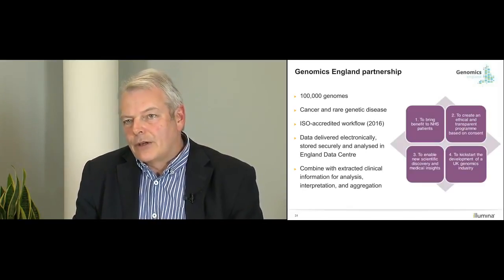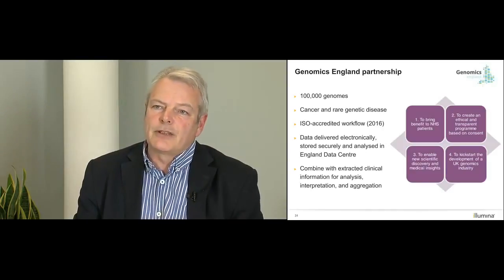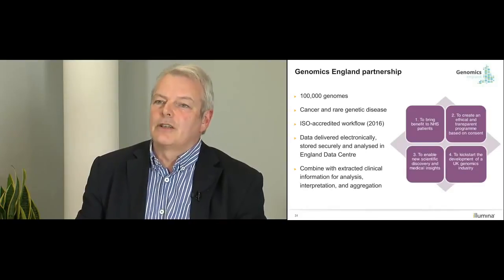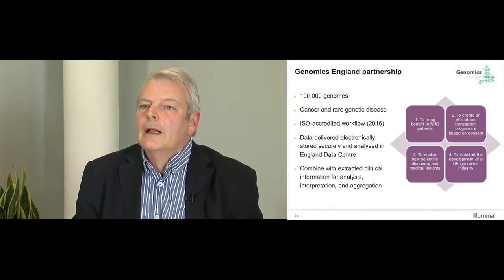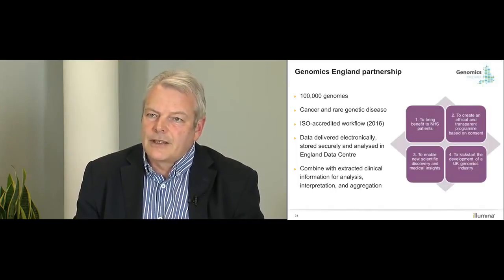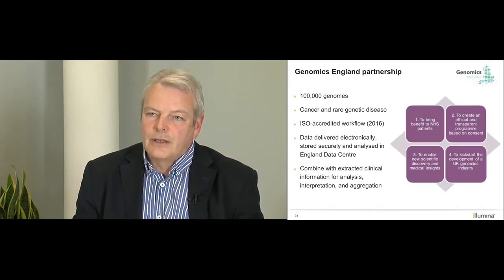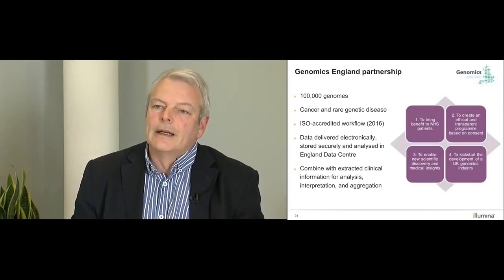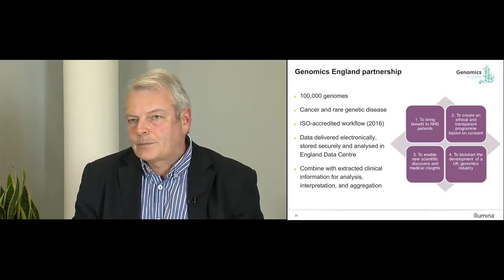We now have an ISO-accredited workflow for this entire process for the whole genome sequencing through to annotated genomes. The interpretation is not yet in that position. And the data are delivered securely and electronically to the Genomics England data center to be utilized for clinical analysis and also aggregation and interpretation.